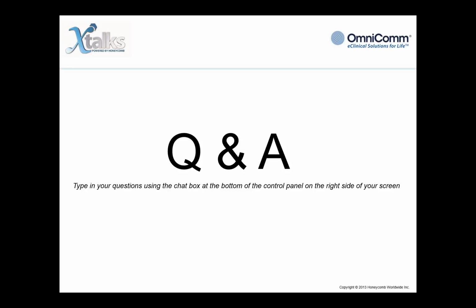Okay. The S4 is a new transmitter and does not yet support SpO2. The T12S transmitter that we have is the SpO2 transmitter. So not at this point.